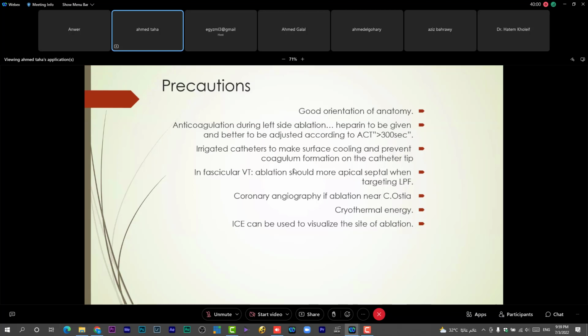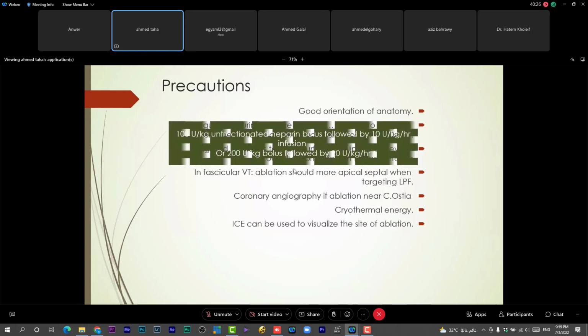ICE will give you better stability during ablation and can identify how much energy you are trying to give, and also identify if emboli or thromboembolism are produced, or, for example, pops can happen, and this should be identified during ablation to avoid thromboembolic complication. Okay, this is the protocol for heparin that I give all the time. I start with 100 units per kilogram, then identify the different amount, either infusion or bolus, according to what I have seen during the ACT measurements.